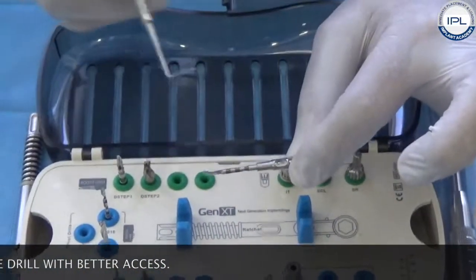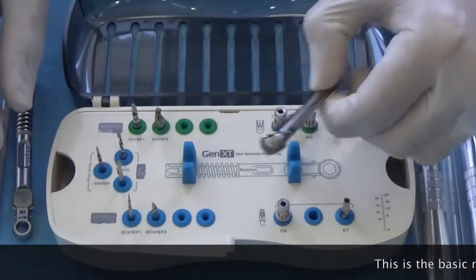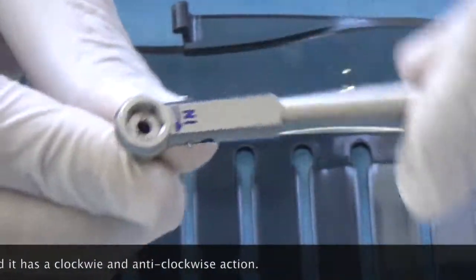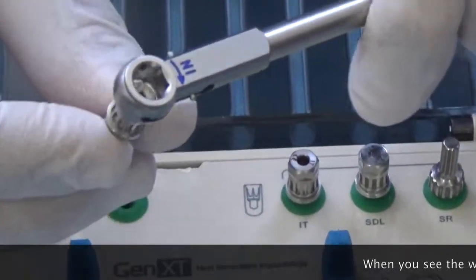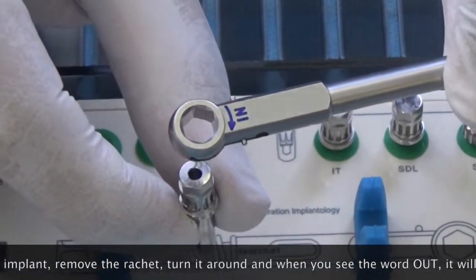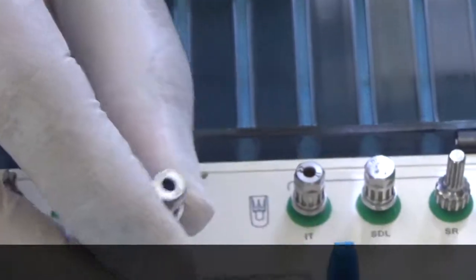If the drill gets stuck inside the drill extender, it's easy to remove — just take your probe, put it into the gap, and turn it, and the drill comes out easily. This is the basic ratchet. It fits on top of the insertion tool and has a clockwise and an anti-clockwise action. When you see the word 'IN,' turning it will go clockwise and insert your implant. To remove the implant, turn the ratchet around until you see the word 'OUT,' and it will work in the anti-clockwise direction.